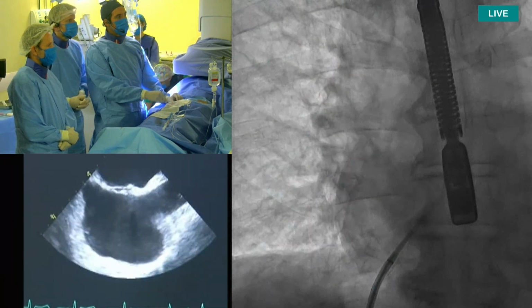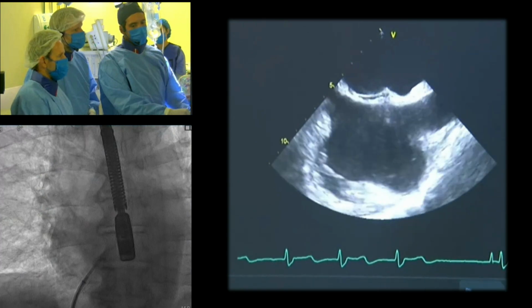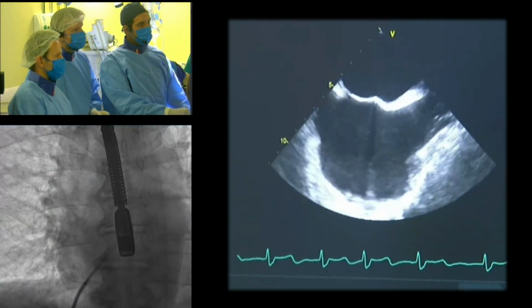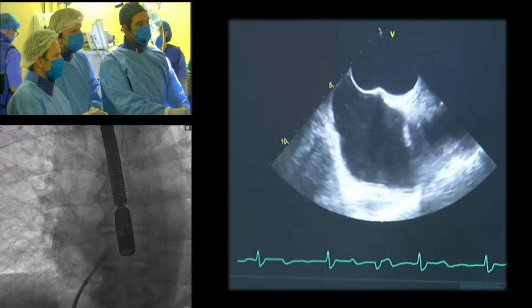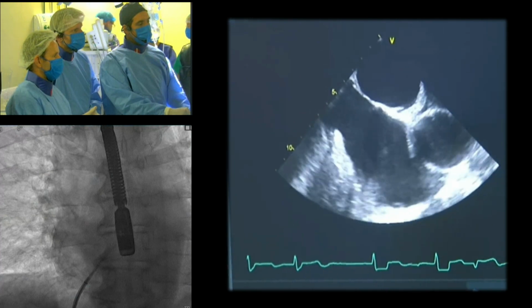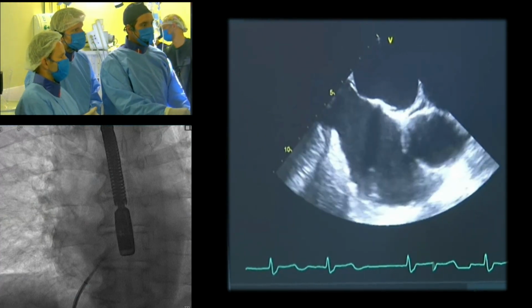Yes. What I typically do if we're in the top of the fossa is ask for the short axis view, because then we know, before we pull a little bit more inferior, if we also give it a little clock posterior or not. So let's ask for the short axis here for the echo. And you see here, short axis, we're not very posterior yet. Yes, we're just more like midish.